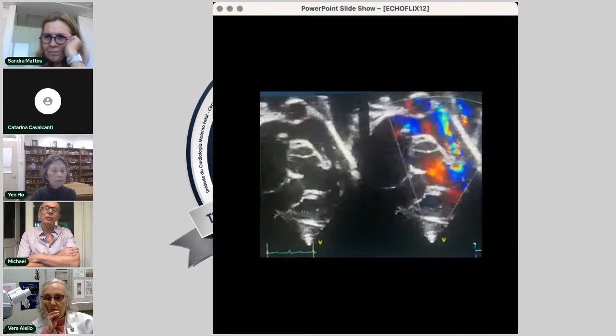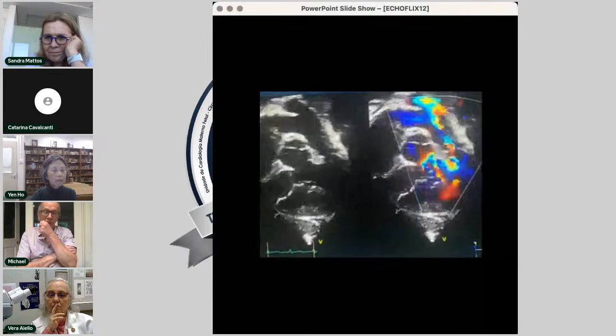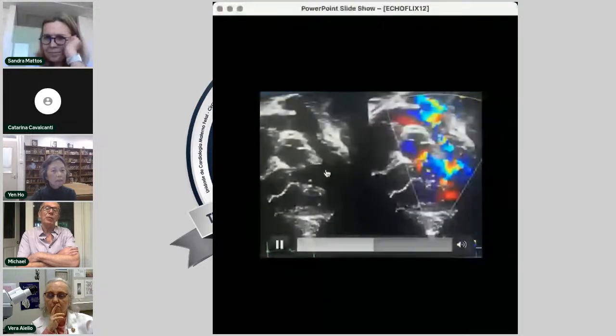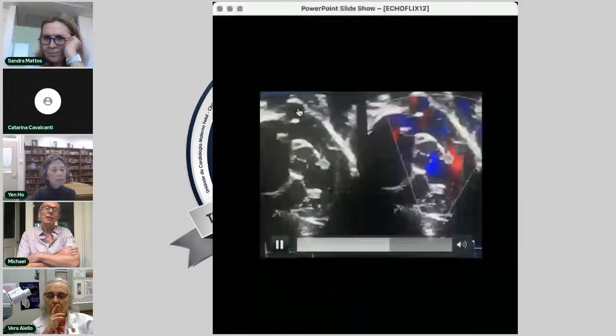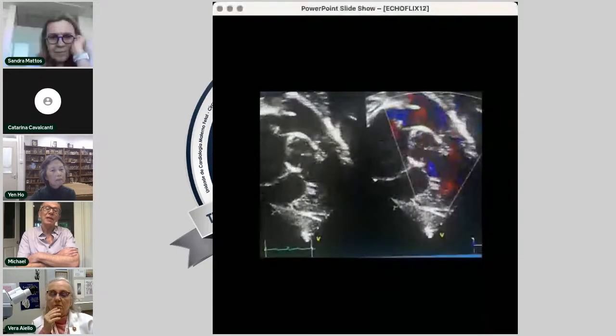Look at this beautiful subcostal right oblique projection, which shows the relatively mild infundibular stenosis. You can see the bifurcation of the pulmonary arteries, and you can see the pulmonary valve itself opening and closing. So it's not surprising that on auscultation, you can actually hear pulmonary valve closure. So mild pulmonary stenosis, mild infundibular stenosis, restrictive VSD, tetralogy of Fallot anatomy.